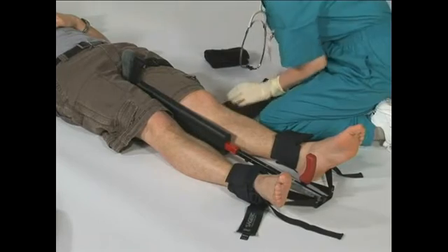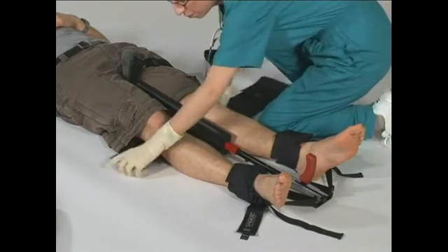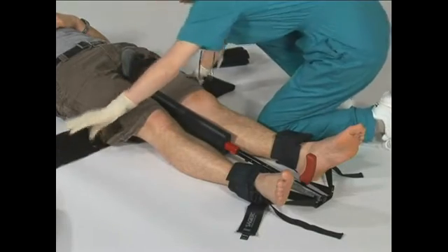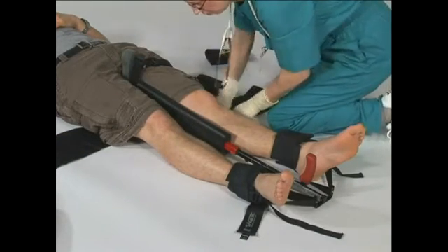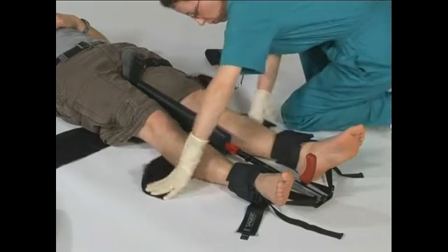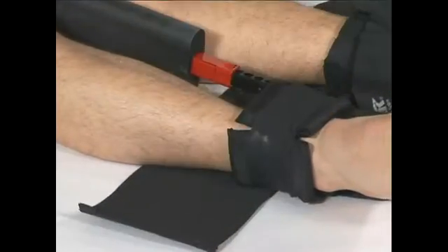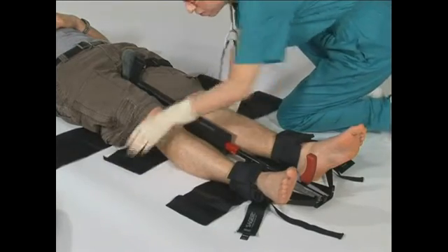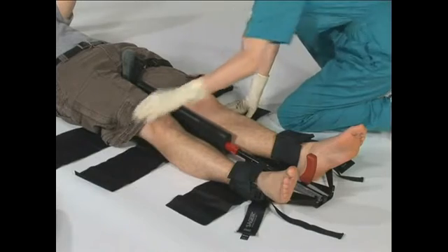At the hollow of the knees, gently slide a large tenser cravat through and upwards to the thigh. Leave it laying flat. Again, gently slide a smaller cravat under the hollow of the knee and seesaw it downward to the calves. Lay it flat. Finally, take a third tenser cravat and insert it under the hollow of the knees. Lay it flat.